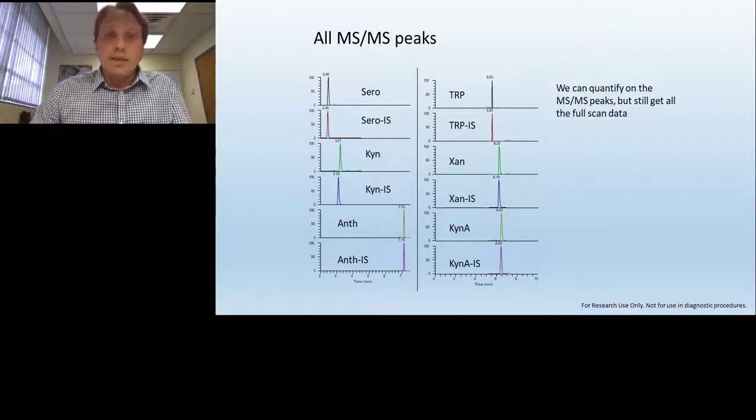You might see how well this works, say, for MSMS. In this case, this is MSMS of each one of those compounds. So it shows very nice performance along with its internal standard. And in this case, we had an internal standard for every compound, and that's very good signal to noise for a good quantitation measurement.